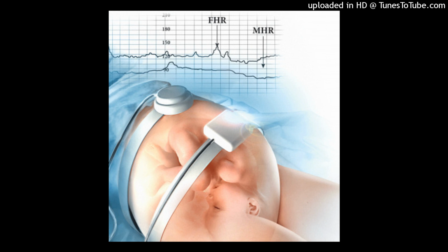The x-axis on the upper and lower graph reveals thin, light vertical lines that represent 10-second intervals. Every 60 seconds, a thick, dark vertical line is printed representing 1-minute intervals. The y-axis also has thin, light horizontal lines, with the upper graph recording FHR in intervals of 10 BPM ranging from 30 to 240 BPM. The y-axis on the lower graph records uterine pressure in increments of 5 mm mercury ranging from 0 to 100 mm mercury.